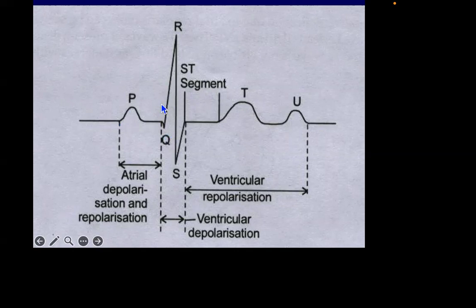And this is the R wave. If you look to the R wave, this is the R wave. The R wave is the first positive deflection after a negative deflection. This is the R wave. And this is the S wave.